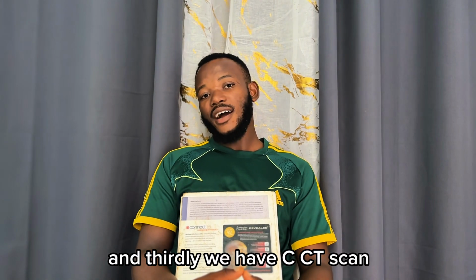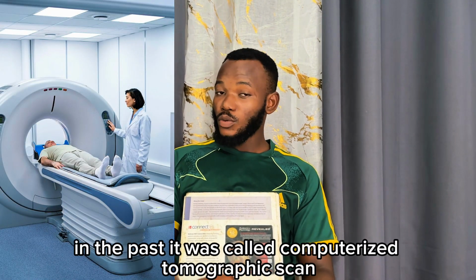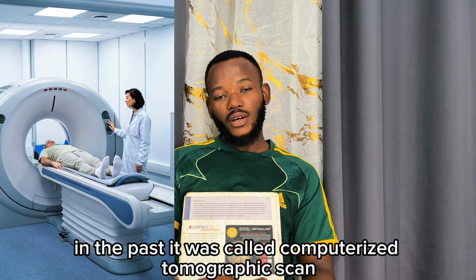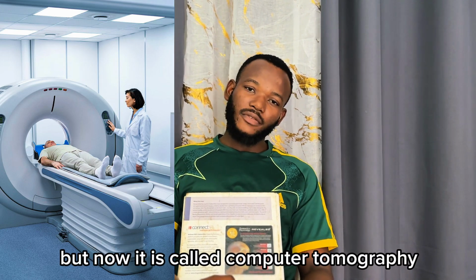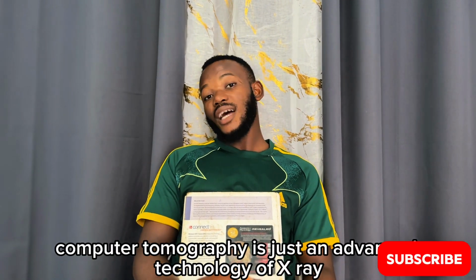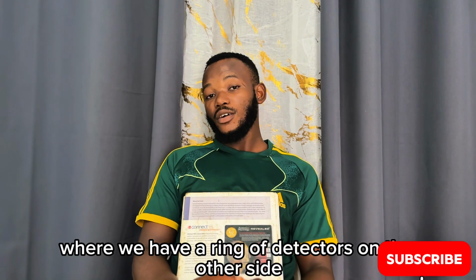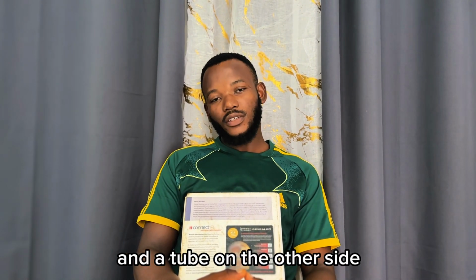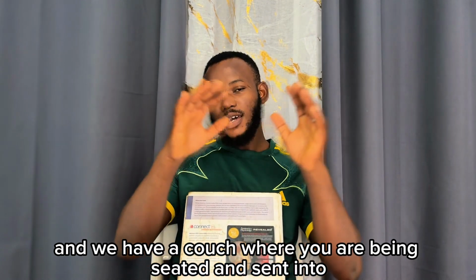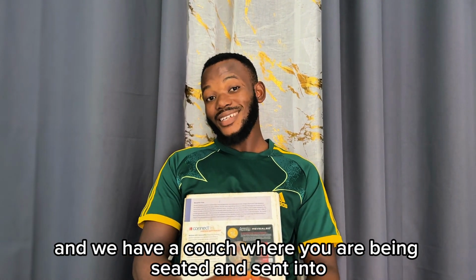And thirdly, we have CT scan, that's computer tomography. In the past, it was called computerized tomographic scan, but now it is called computer tomography. Computer tomography is just an advanced technology of X-ray, where we have a ring of detectors on one side and a tube on the other side, and we have a couch where you are being seated and sent into.